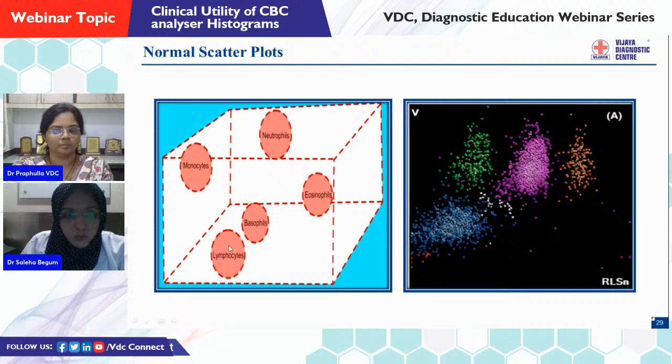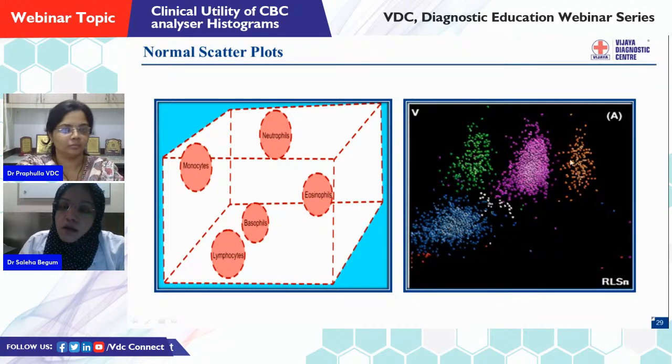The lowermost population is the lymphocyte. Here you can see in the corresponding picture, the blue population is representing lymphocytes. Just above the lymphocyte is the basophil. Here you can see the white dots correspond to basophils. And the extreme right side of the scatter is the eosinophil.